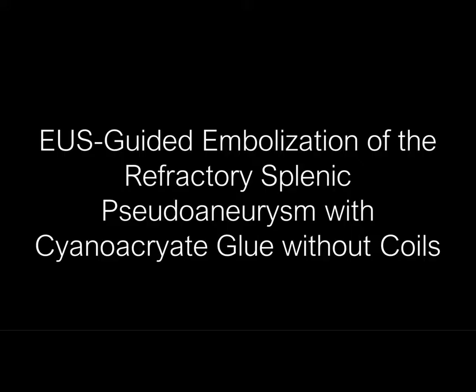Due to continued transfusion requirements in spite of the interventions by our interventional radiology service, the decision was made to perform EUS-guided splenic pseudoaneurysmal obliteration with thrombin and cyanoacrylate glue.